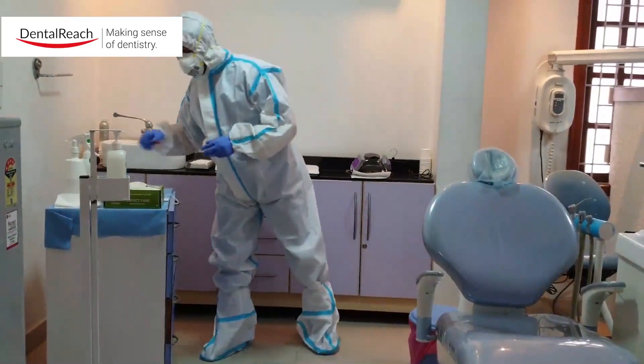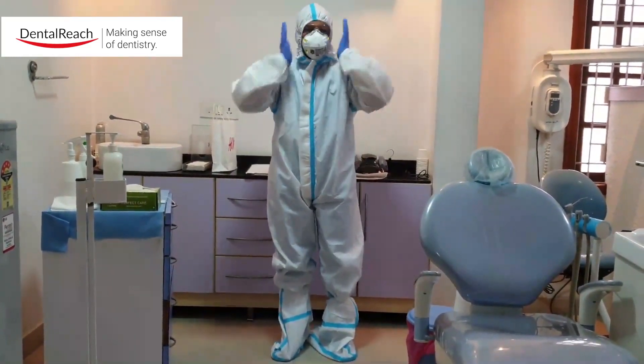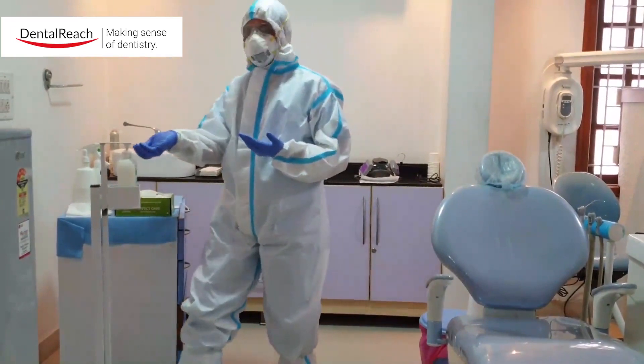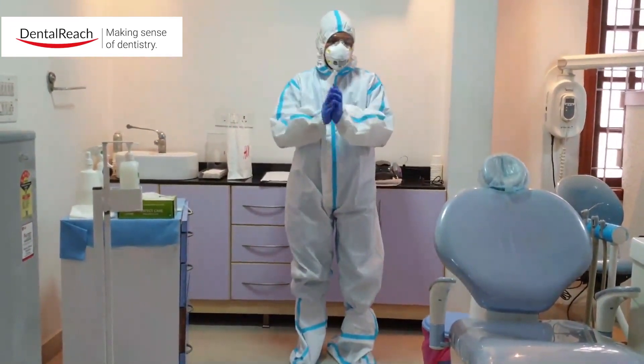The next thing we will do is wear the safety eyewear. At this point we are all set to treat the patient. I just sanitize myself once again before I sit on the chair.